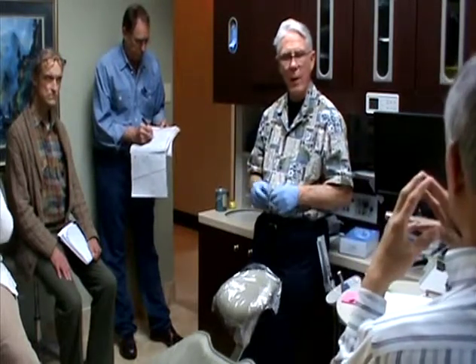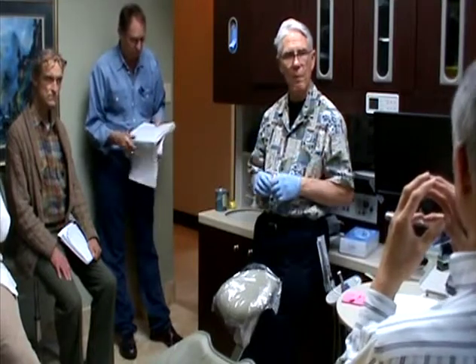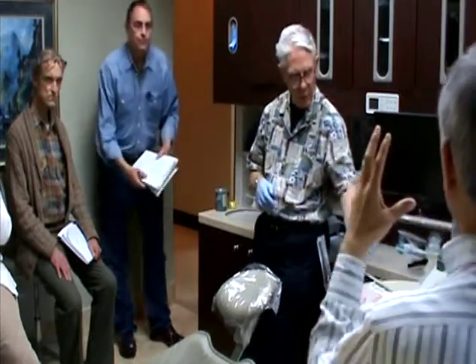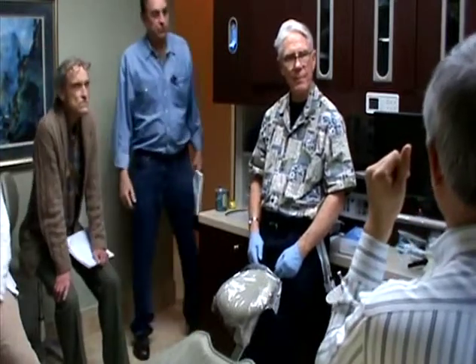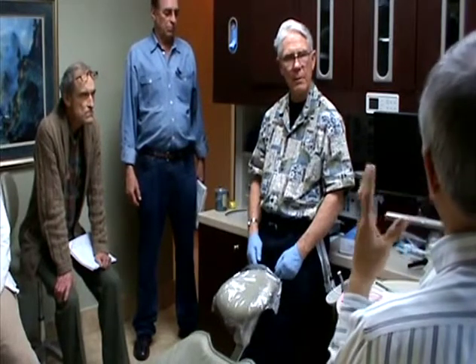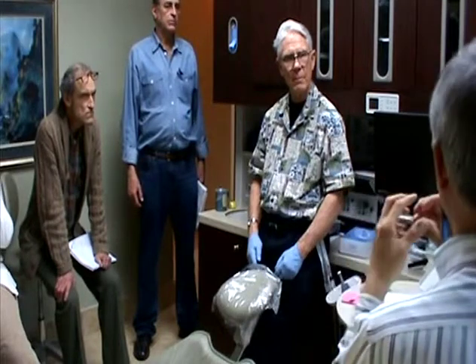How long do you think that would take to come down? Everybody's different. How hard, how is everybody's cranial frozen? How bad? And how limber are they? And how big are they, and how small are they? But you can make that happen without unlocking the premaxilla with an alpha appliance? Yeah, you go in after you do that, loosen up all your sutures. Am I better off just getting an alpha appliance to just get the sutures to open up?